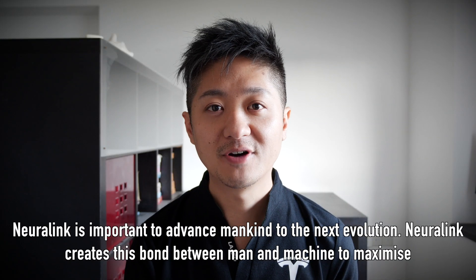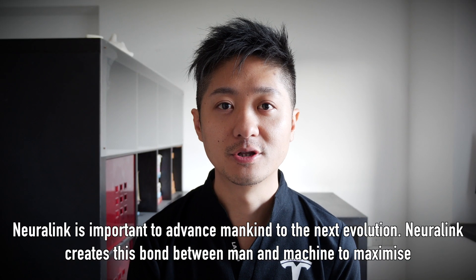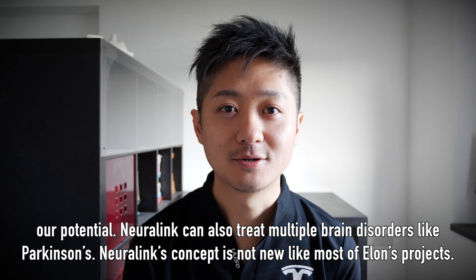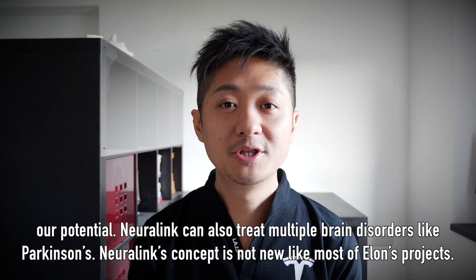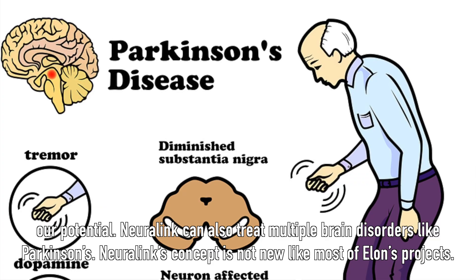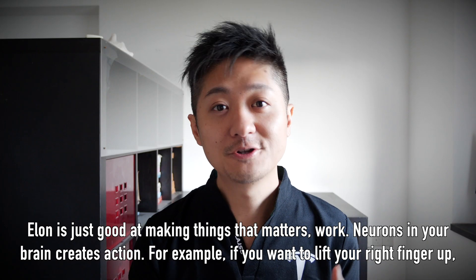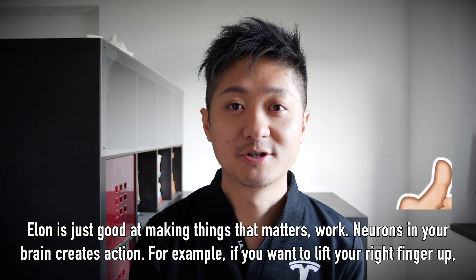Neuralink is important to advance mankind to the next evolution. It creates this bond between man and machine to maximize our potential. Neuralink can also treat multiple brain disorders — an example is Parkinson's. Neuralink's concept is not new, just like most of Elon's projects. Elon is just good at making things that matter work.